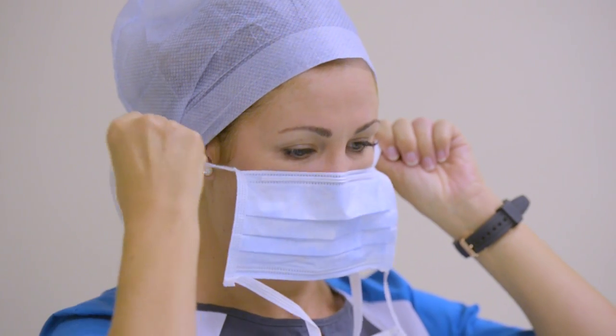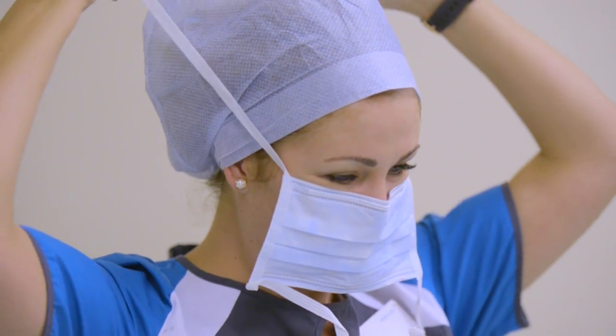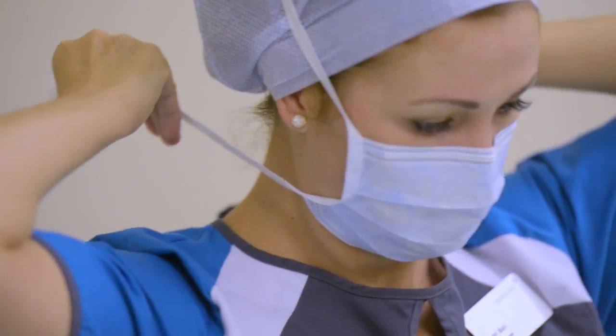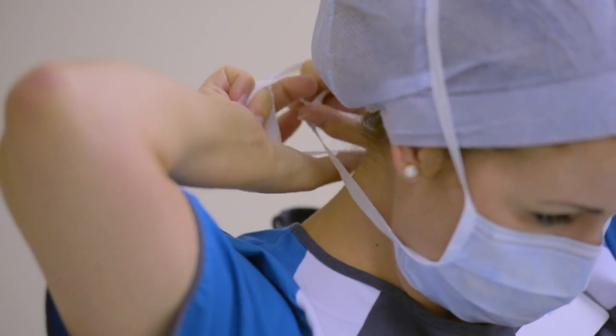The mask is there to protect the wearer from any splashes. It also protects the patient from any microorganisms that we as the wearer might have. The goggles and visor mask are purely there to protect the wearer from any splashes like body fluids or blood from the patient.